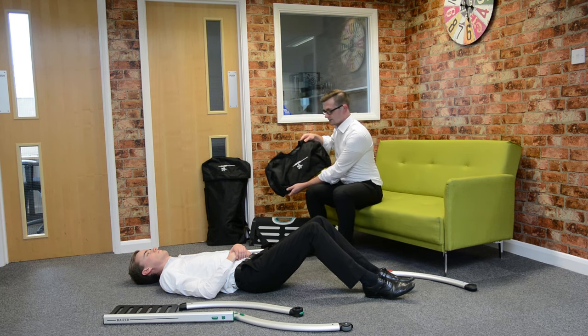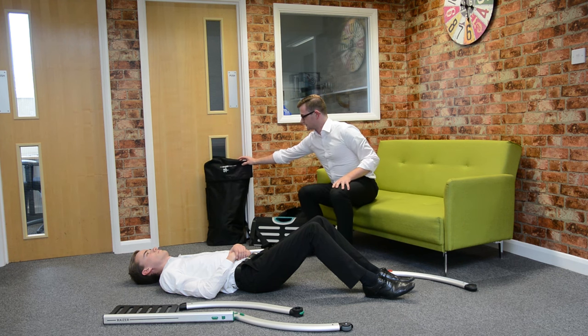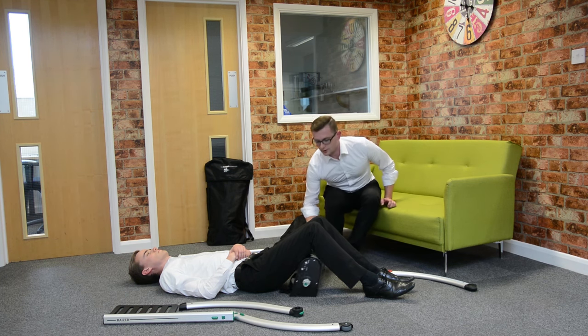It comes in two packages. The seat comes in this, and the three parts of each side come in this backpack. Starting with the seat part of the chair, this goes under the legs.